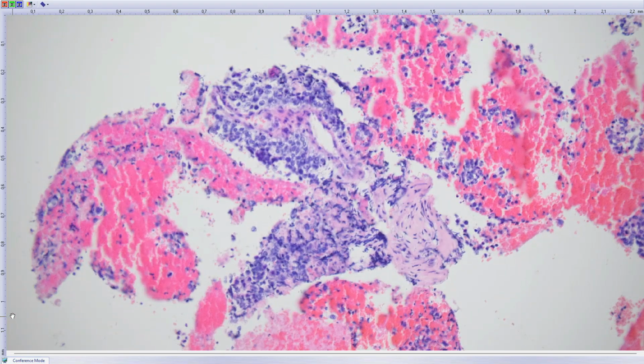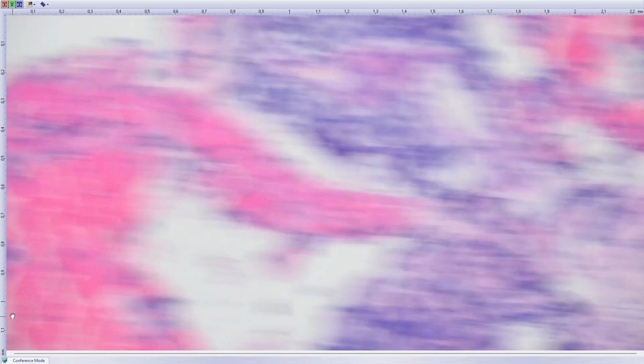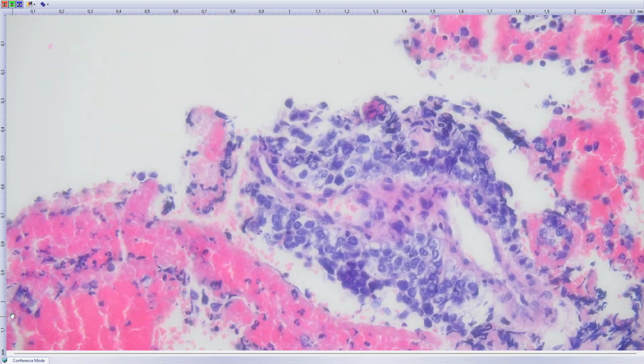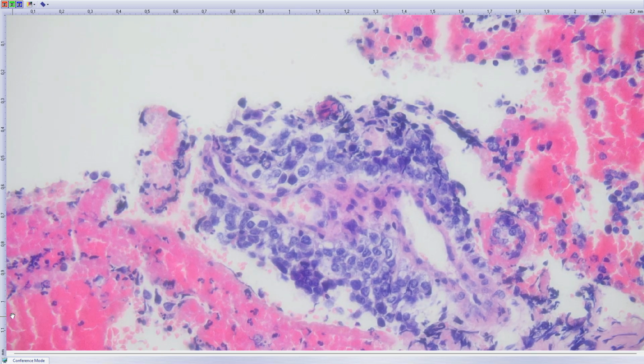Is this essentially a small round blue cell tumor in an elderly adult patient? They performed many immunohistochemical stains, and only PRAME immuno was positive, but all melanoma markers were negative.